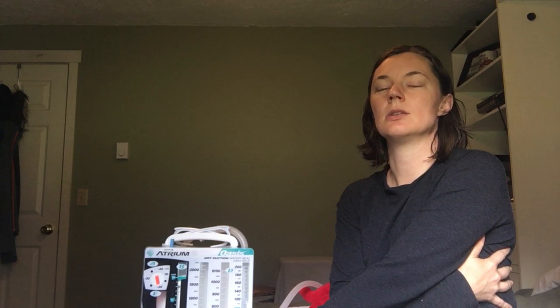We don't want to leave a dressing on it and keep infection-causing moisture near there. We want to open a shower, wash it off, pat it dry. That moisture helps loosen things and helps sore muscles, helps your patient to feel better. And it's totally fine to do that as long as you have orders for them to be okay to come off of suction to walk, then they can shower.